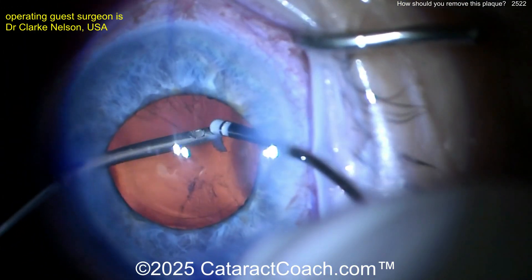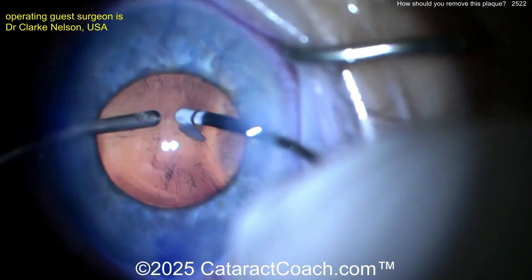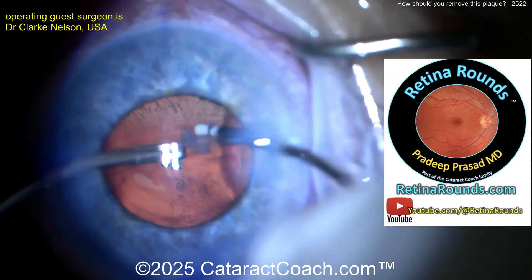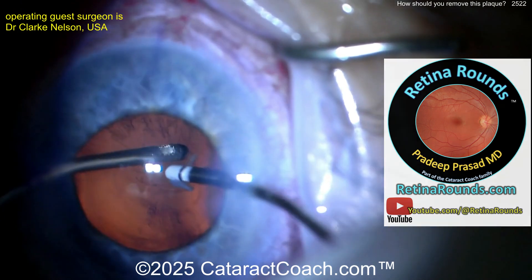Going in with the IA probe to try to do this by manual approach to remove that central posterior plaque here. Again, the patient's already had a vitrectomy. You can learn more about vitrectomies at retinorounds.com, our sister channel. It is live right now. You definitely got to check it out. I promise you're going to learn a lot.